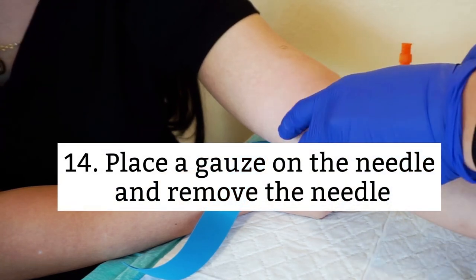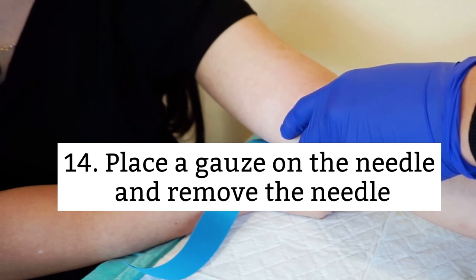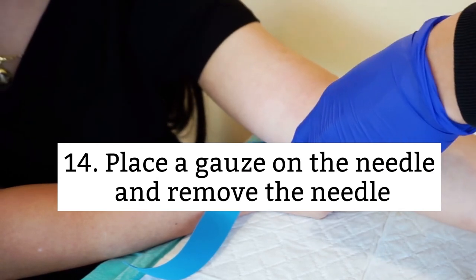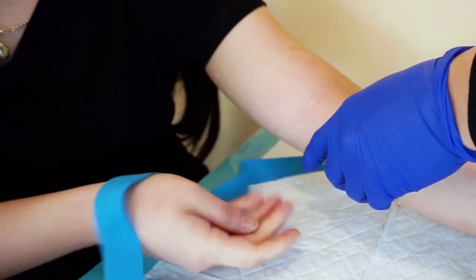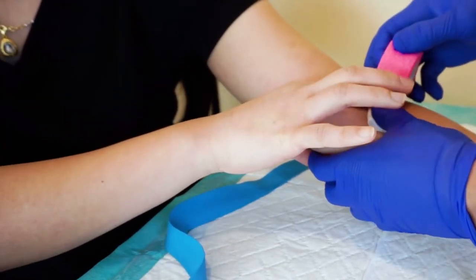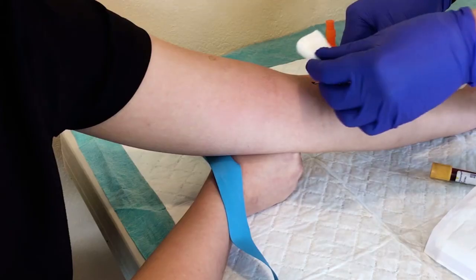Fourteen, when you draw the last tube, place a gauze on the needle and remove the needle. Do not press down on the gauze because you will press on the needle that is still in the patient's arm. You can also ask the patients to hold the gauze. I usually ask the patient to hold the gauze because that reduces my risk of finger prick as I remove the needle from the patient's arm.